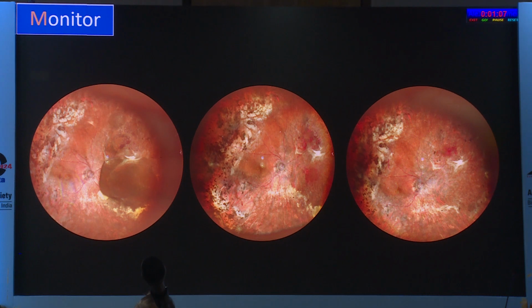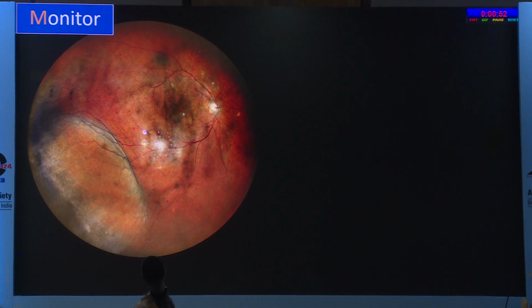patient. We know fundus fluorescein angiography might help in this situation, but you cannot keep doing fundus fluorescein angiography every time you have a doubt. So many times, wide field color fundus imaging comes to the rescue, but it cannot replace wide field fundus fluorescein angiography. This is another interesting case where we gave an intravitreal injection for this diabetic macular edema patient 2 months back.